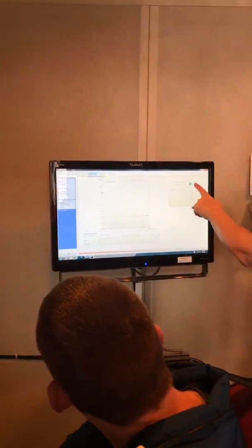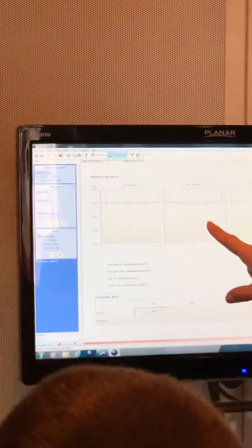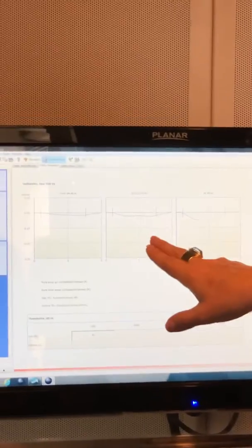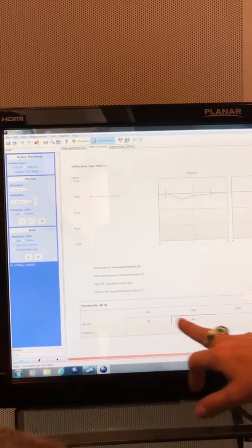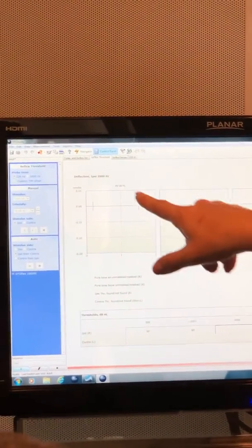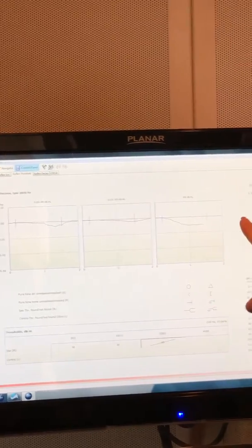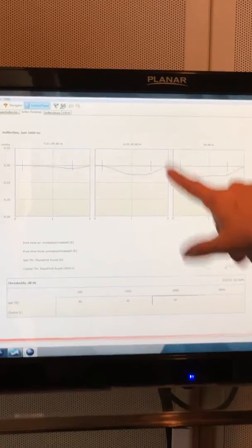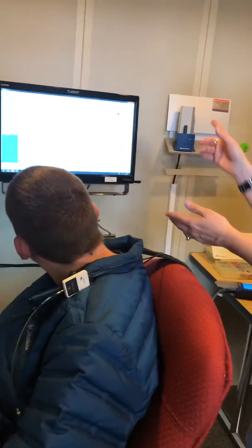I push play — the arrow button — and it tells me I have a good seal. The tympanogram reading went really quick. Now it's going into reflexes, presenting a tone at 80 dB — no response; 85 dB — no response; it's looking for about a 0.3 deflection. It's going through 500, 1000, 2000 Hz. You can see that muscle contracting — that's the stapedius muscle. Here are the thresholds at 500, 1000, 2000, and 4000 Hz — that's ipsilateral.